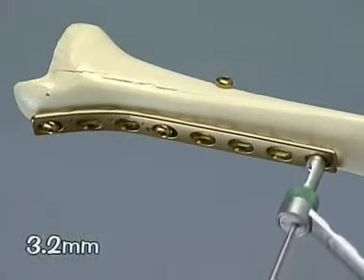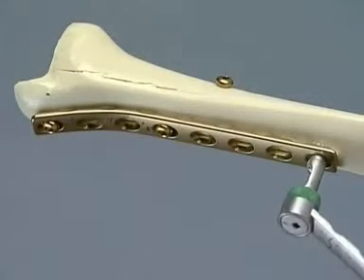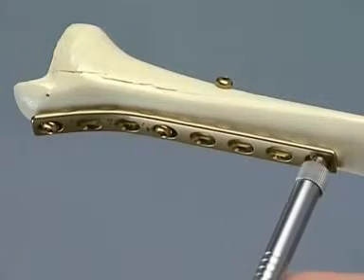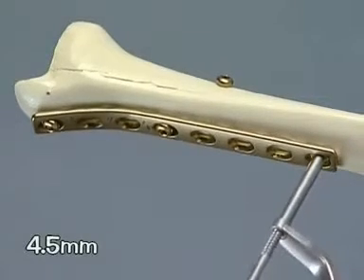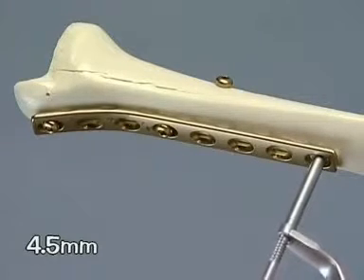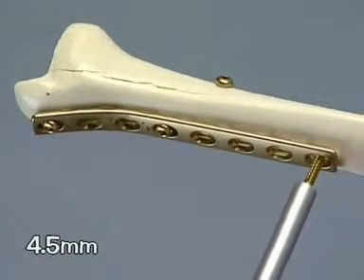A cortex screw will be placed in the most proximal plate hole. Drill the hole with the 3.2 millimeter drill bit. Measure the depth. Tap using the 4.5 millimeter tap. And insert the 4.5 millimeter cortex screw.